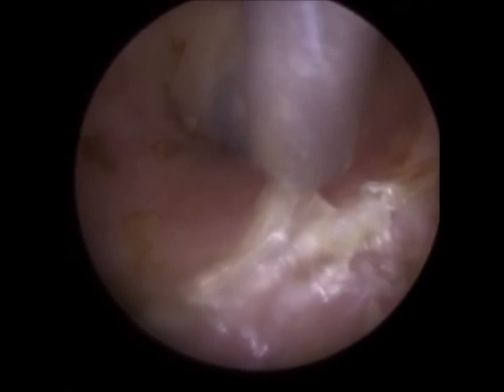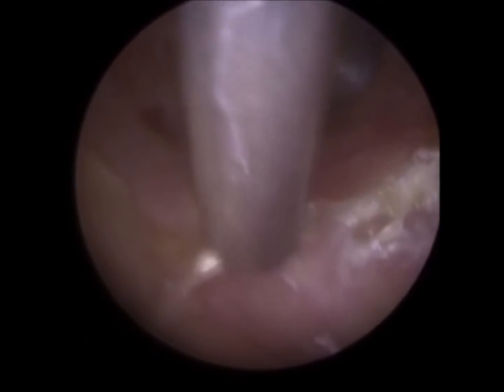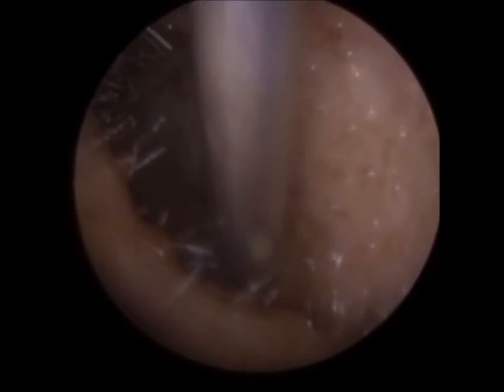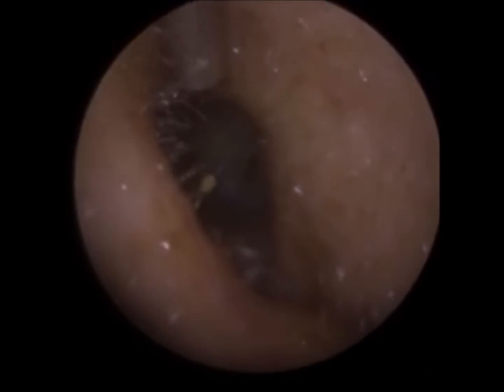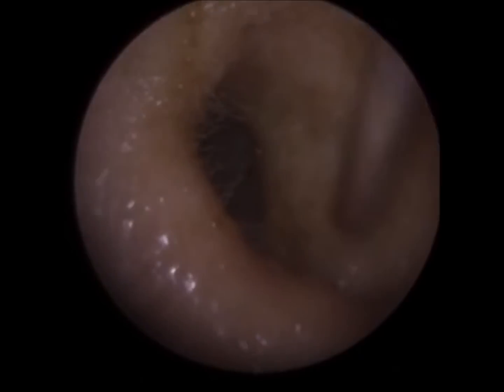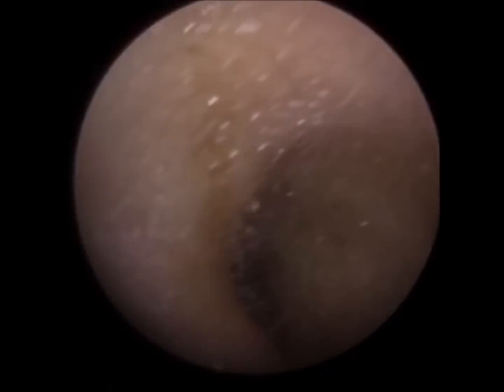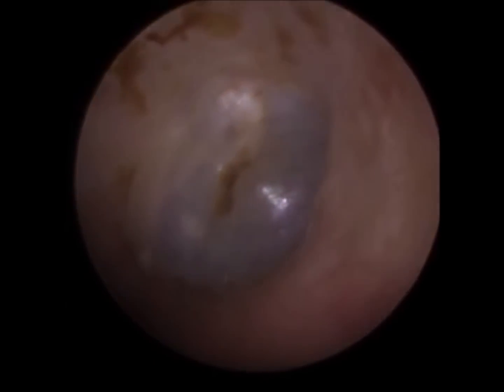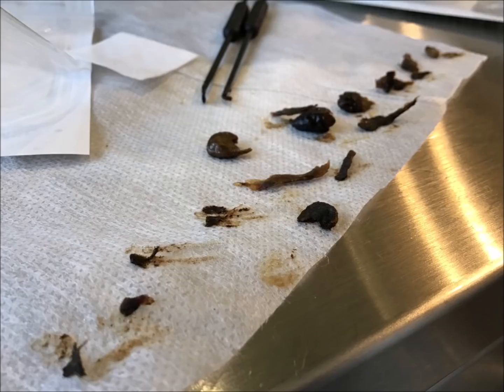And again, I have to stress to people when we do perform earwax removal, most people watching this will have a bit of dry skin like this that's slightly shed. It's absolutely normal. However, I am aware some people do obviously watch the videos to make sure everything's nice and clean, but clinically there's no need. There's the eardrum, good light reflex there. There's all the contents. I've got 3 still images.